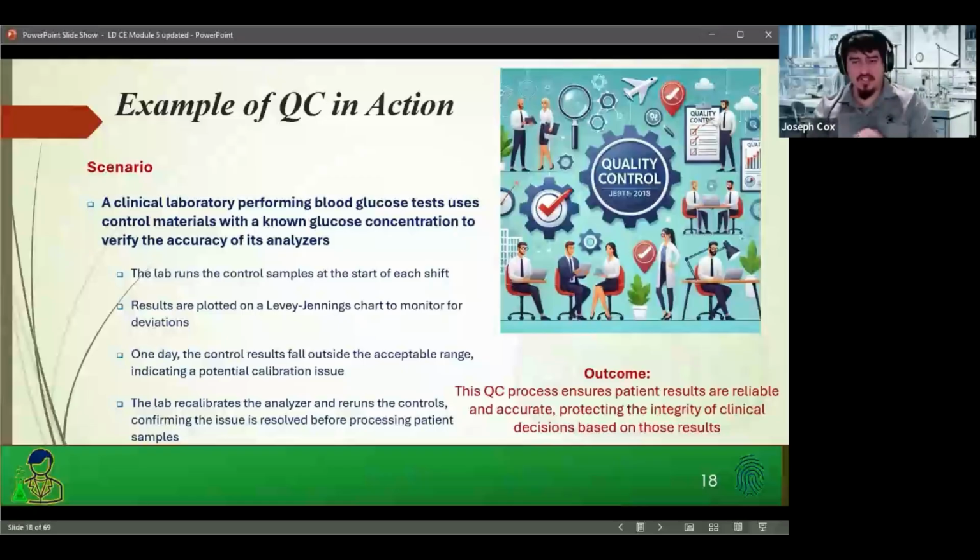If you're from a forensic setting, oftentimes you'll run your QC with your set of tests. So you'll do your extraction, you have your QC, which is fine. That's good in a non-clinical setting. But in a clinical setting, especially with an analyzer here for blood glucose, the way the LIS and the EMRs are set up, the data goes straight from the instrument into the LIS and is then accessible to nurses, doctors, and, if the result is submitted out, to patients. People can access that and see it.